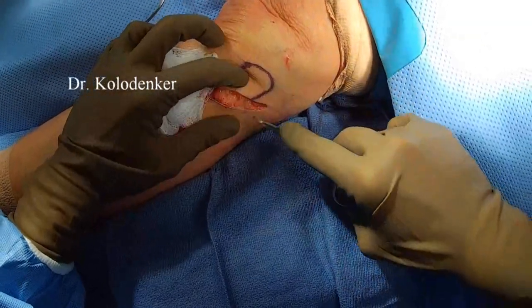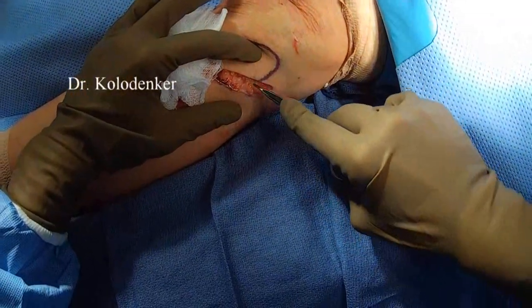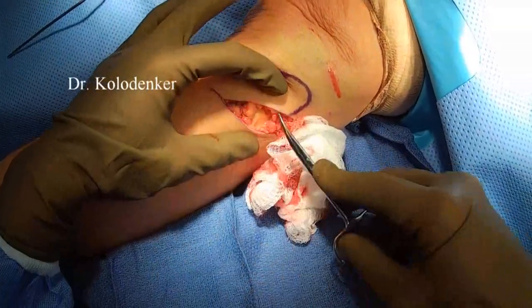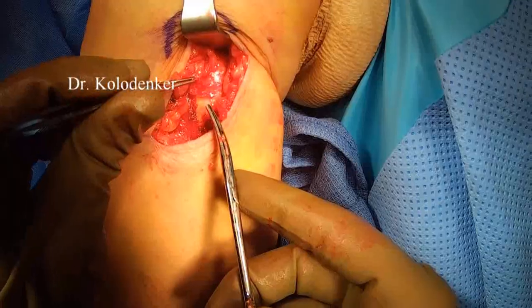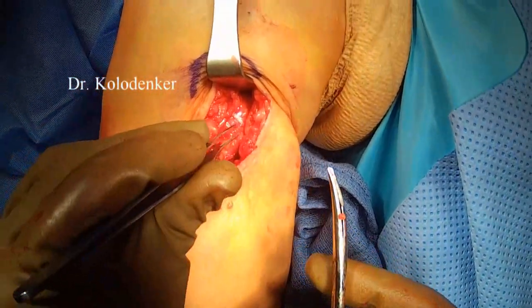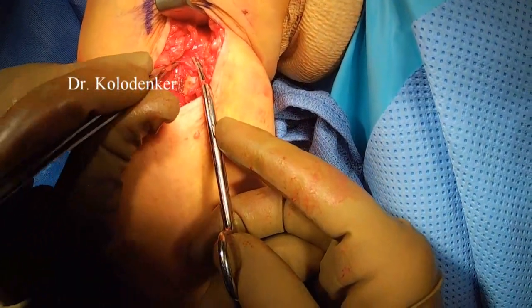A very delicate surgery. Here you can see the incision line and the tissue dissection, very carefully making sure not to injure the common peroneal nerve, as it is responsible for working the anterior muscle groups.